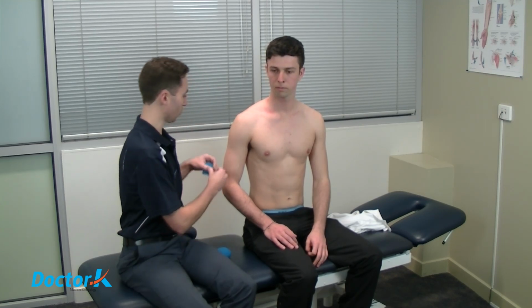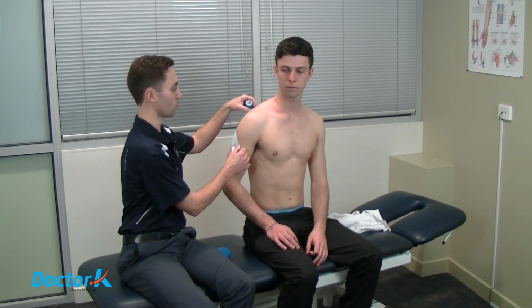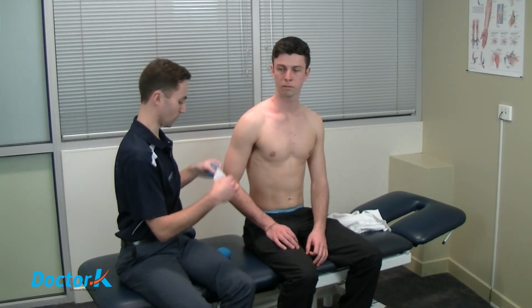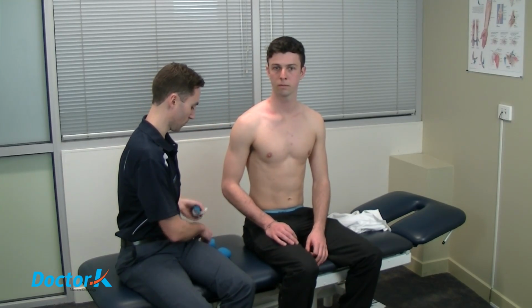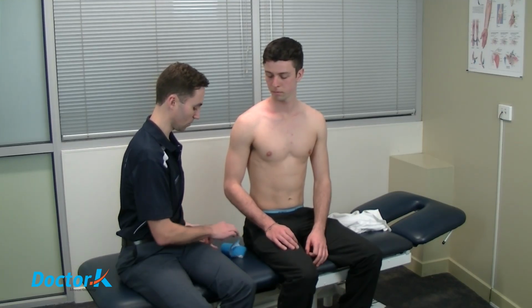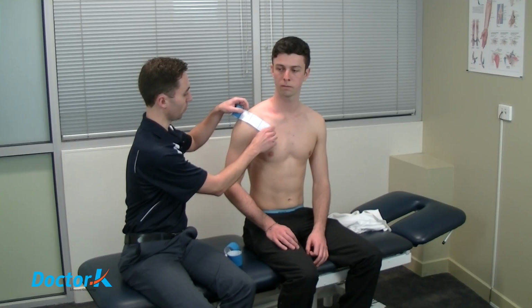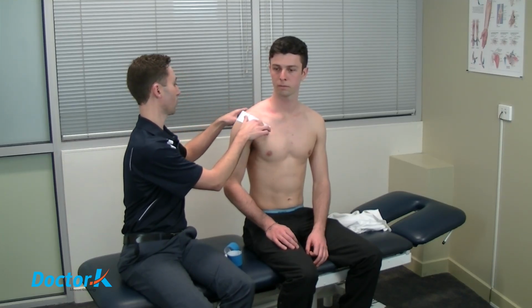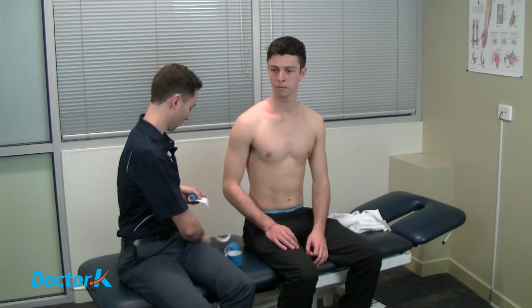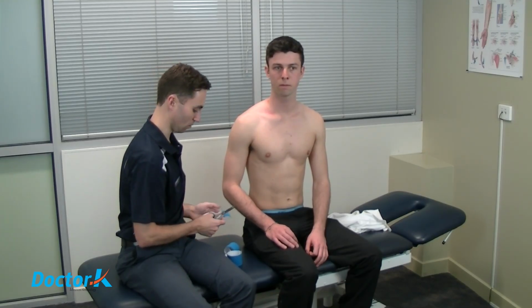And we're going to measure another piece that goes from that same point probably around to the bony ridge of your shoulder blade on the back. So that's going to again provide an allowance for it to stretch a little along the way. And then our third piece is going to run from the front of the chest across around that point of shoulder to around where your shoulder blade begins. So as with each of our taping applications, we're going to cut the corners off.